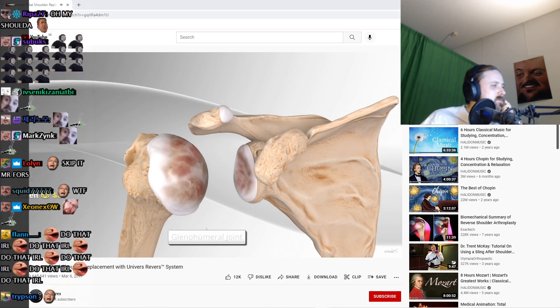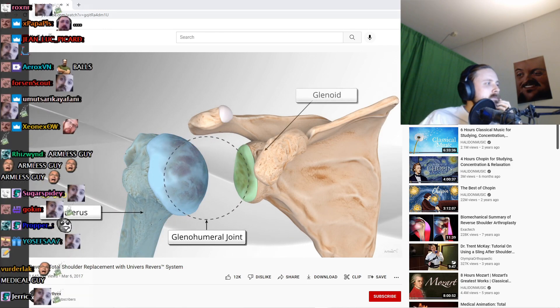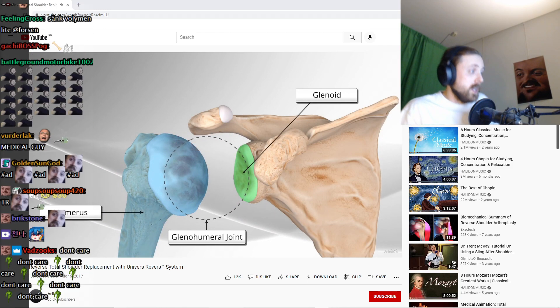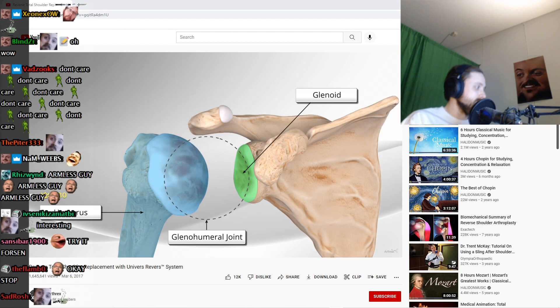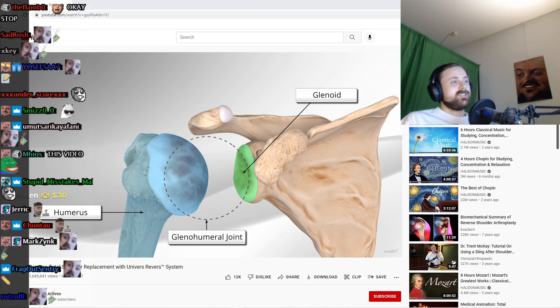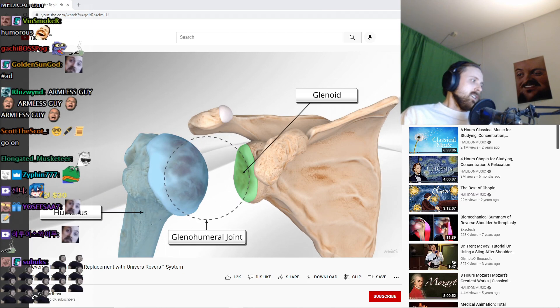The shoulder joint, or the glenohumeral joint, is between the head of the humerus and the glenoid cavity. The most reliable surgical option to relieve pain is a special replacement that switches the ball out with a socket and the socket out with a ball, also called reverse shoulder replacement.